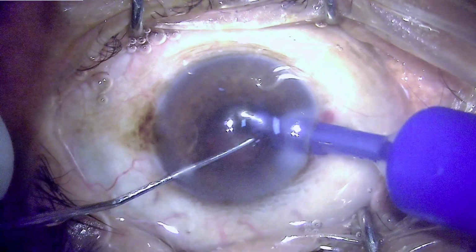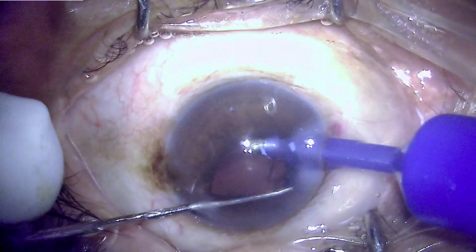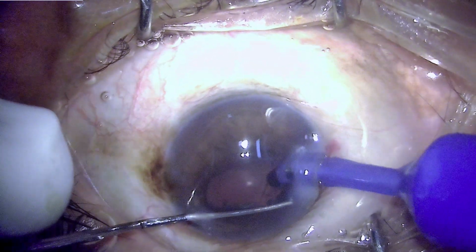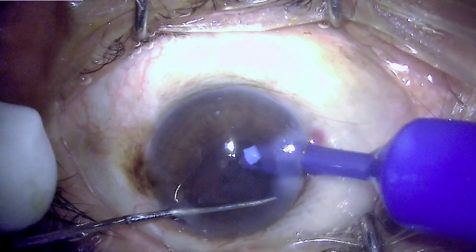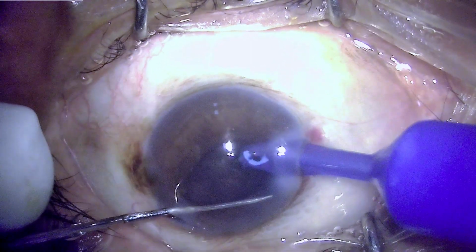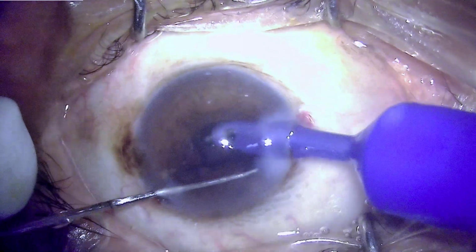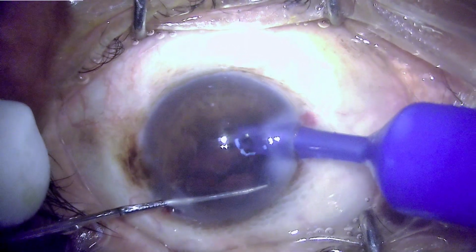So this is a very effective bimanual technique of pulling away the iris so that the underlying nucleus or epinucleus, or for that matter even the cortex, can be seen and differentiated from the capsule and aspirated safely.